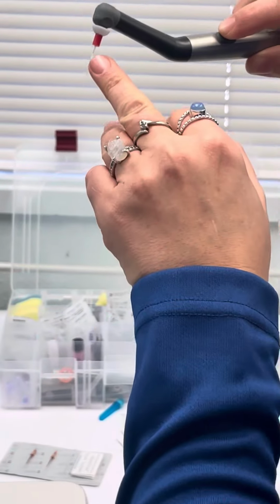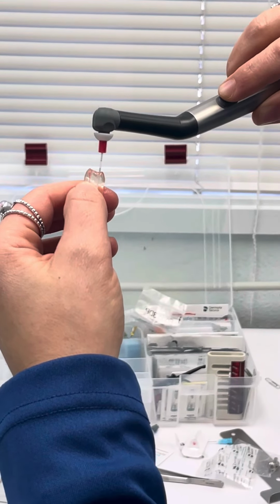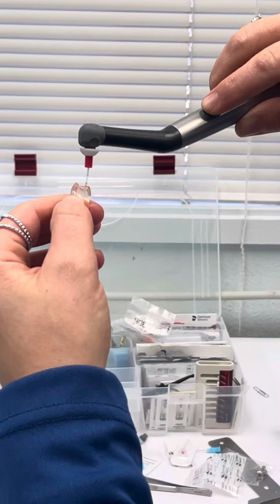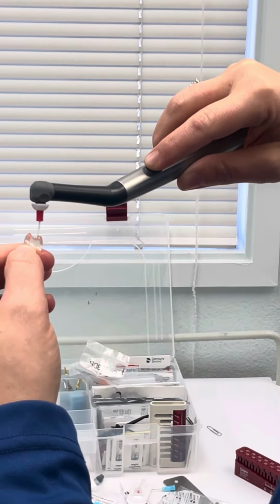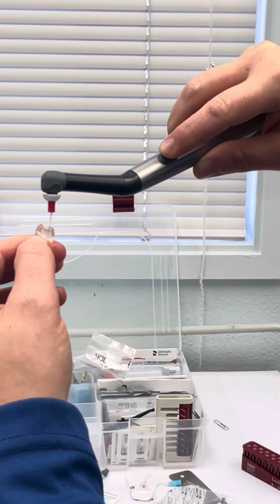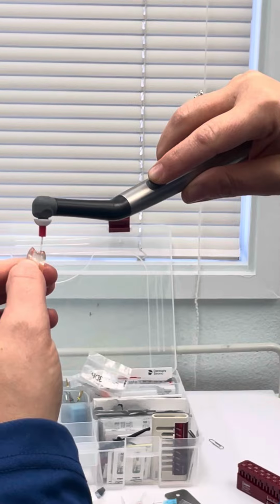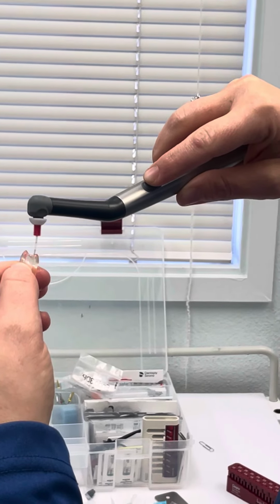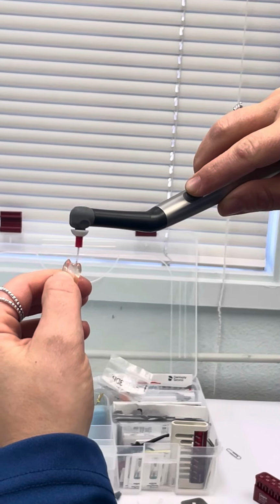As you can see, there's the same guide there for your length. So you're going to go to your 20, just swirl away. Some people ask me, do I do this? Honestly, you don't have to. It's like an electric toothbrush. You just set it there and let it do its job, but sometimes you feel like you're needed, so then you go like this. Either way, as long as you're not pushing this thing past the apex, you're going to be just fine. This is going to give you a beep when it's at 30 seconds.